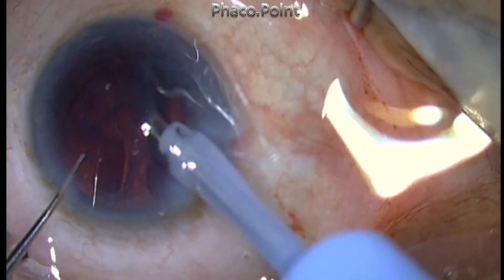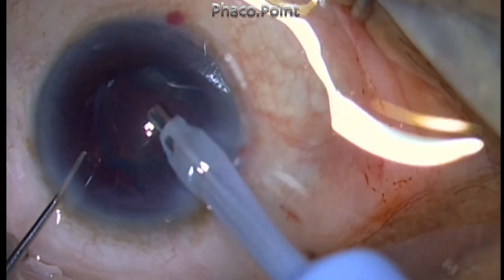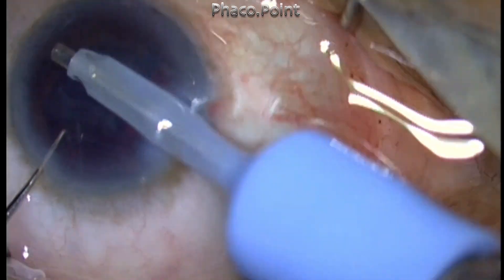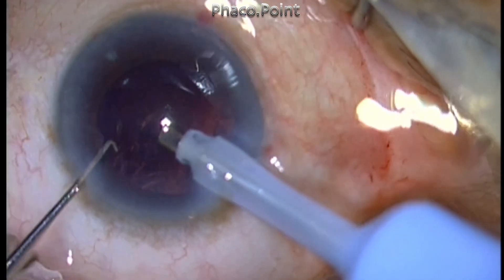So before you try any other technique of handling the soft cataract, if you end up with a crater formation, first try the visco lift. And if that fails, then you can use a horizontal chop or other maneuvers in order to handle the cataract. I thank you for your attention.